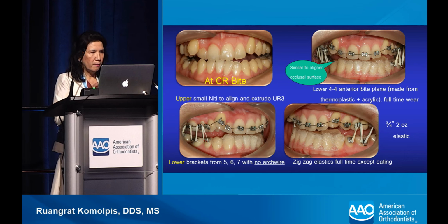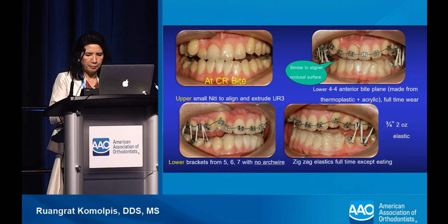Look at this bite block. It looks like an aligner's occlusal surface, right? So we're going to use an aligner to do the same thing as this case later.